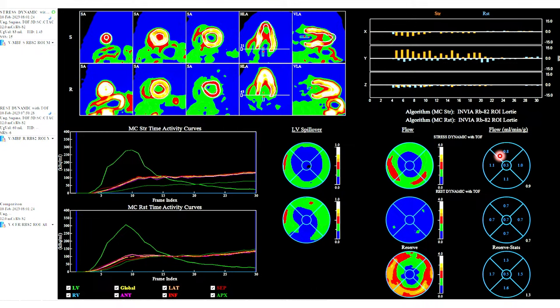So in the flow data, we can see what's happening here: even the pixels that are not hypertrophic, in apical HCM, on echo or MRI, segments that have not been hypertrophic, you see the flow is also reduced. So you're referring to the periphery at the base? That's like the top right map?